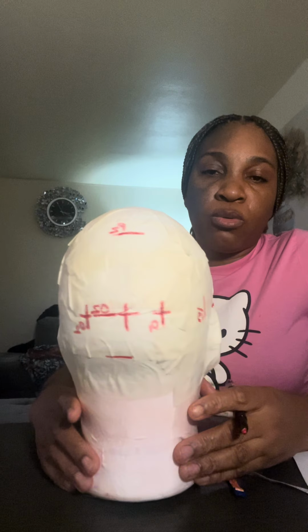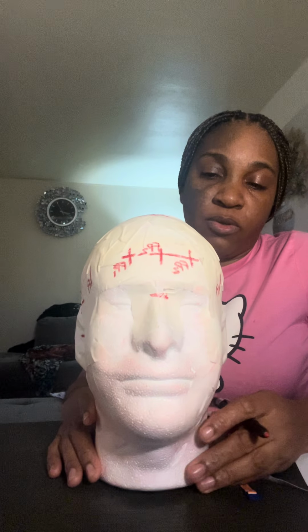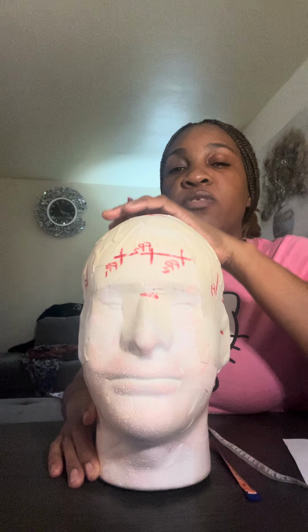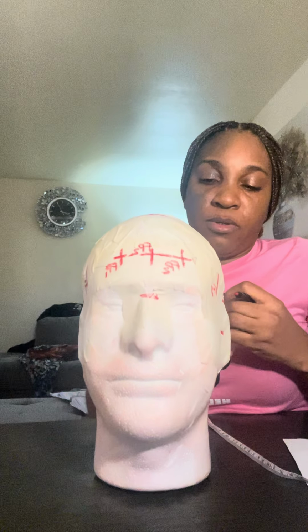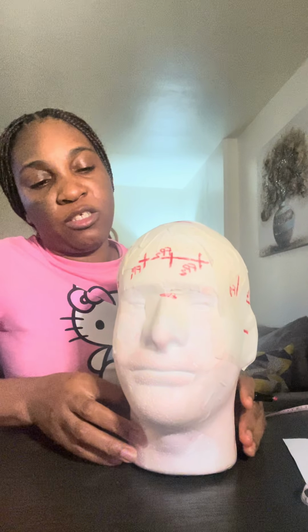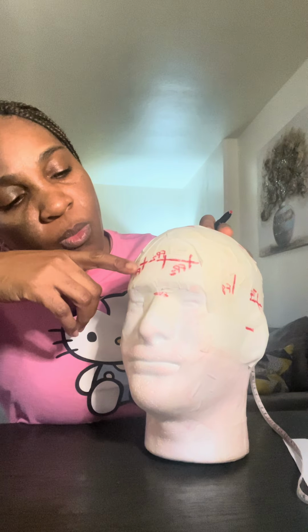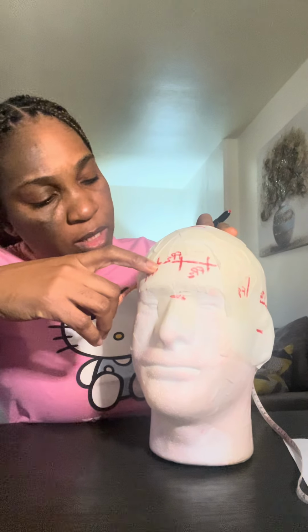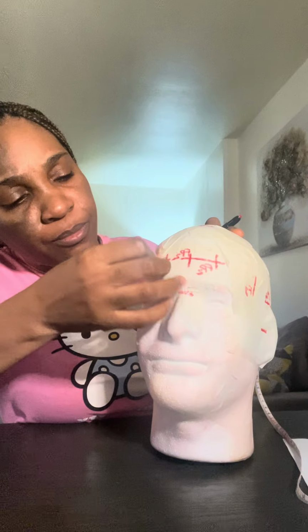So the next measurement is going to be my parasagittal. We have the parasagittal left and parasagittal right. I'm going to start with my parasagittal left. I'm going to take it from FP1, the true line on FP1, going through C3 back to O1.